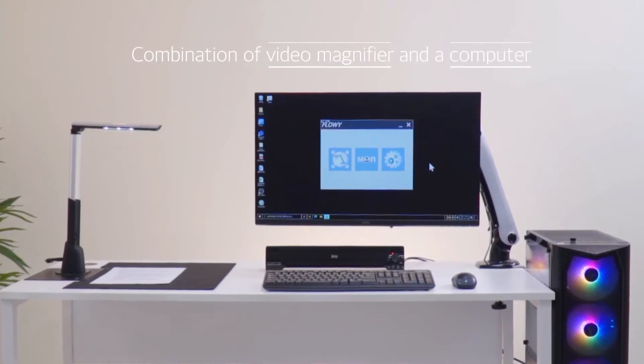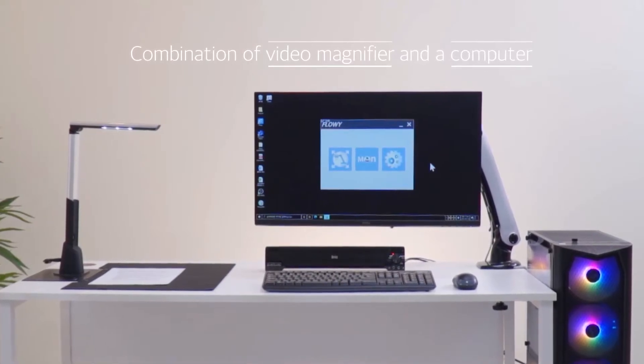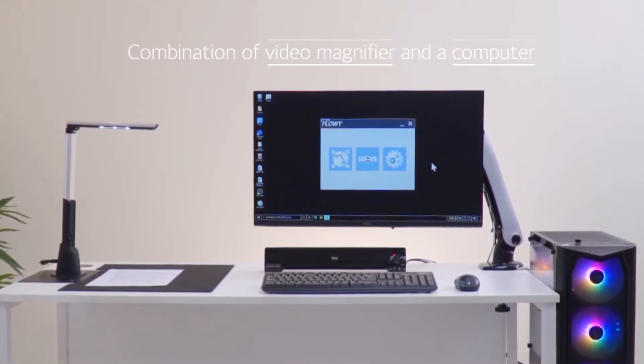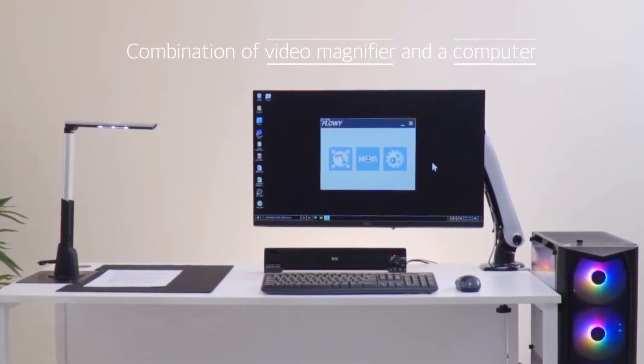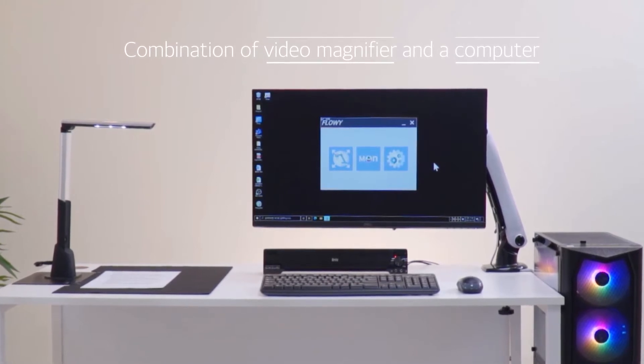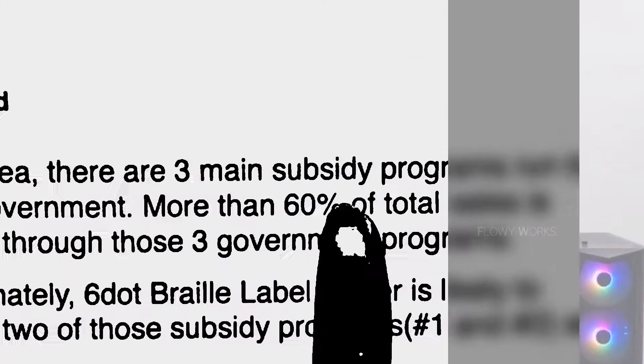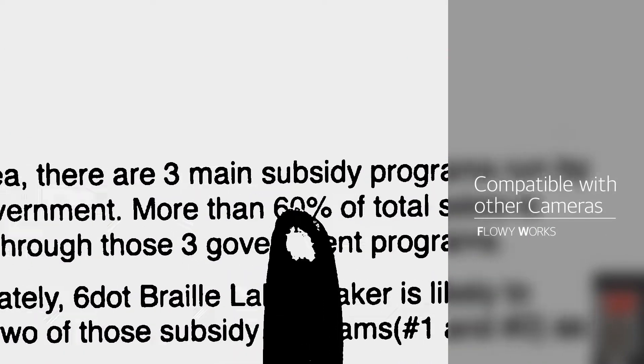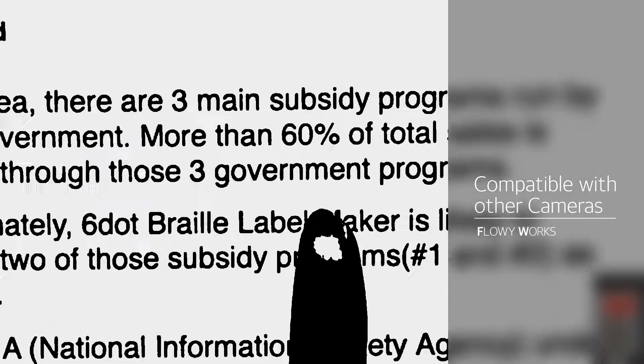Flowyworks increases your work productivity with its powerful video magnifier and advanced screen magnification features. This magnifies efficiency by making it compatible with other cameras.